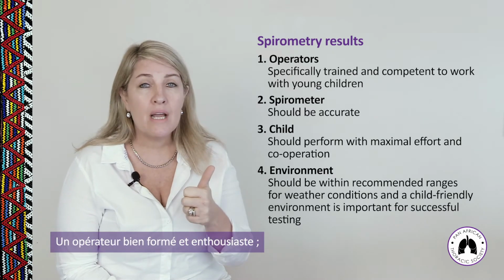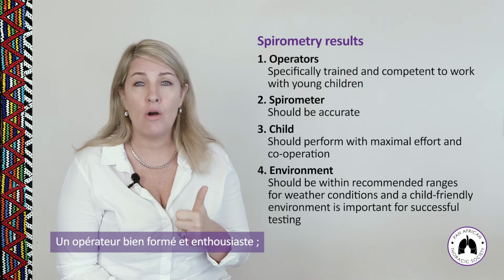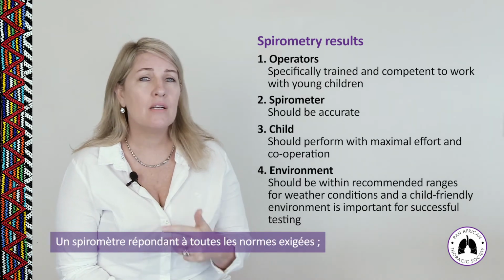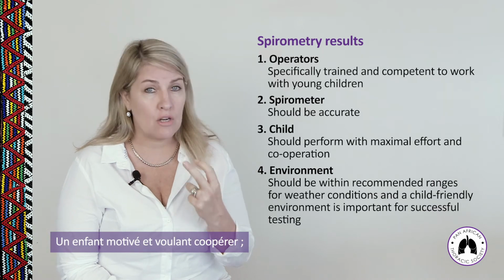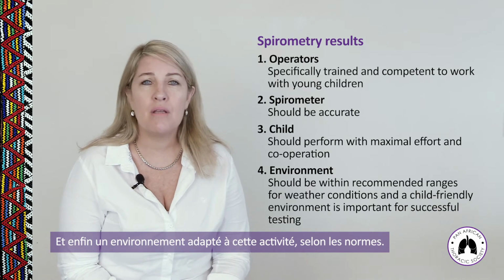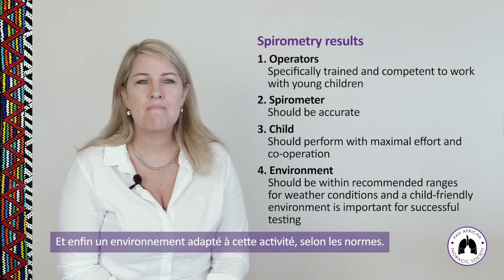That's a well-trained, motivated, and enthusiastic operator, a spirometer which meets all the technical requirements, a child that is well-motivated and cooperative, and lastly, an environment that is within the limits for ambient conditions and is child-friendly.